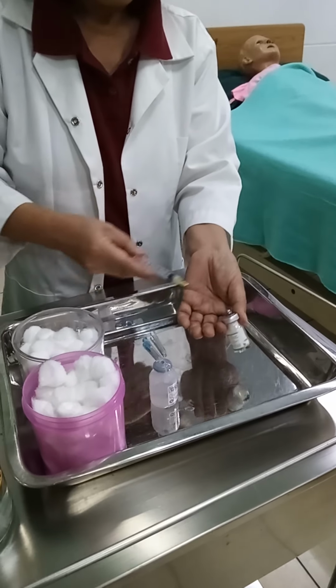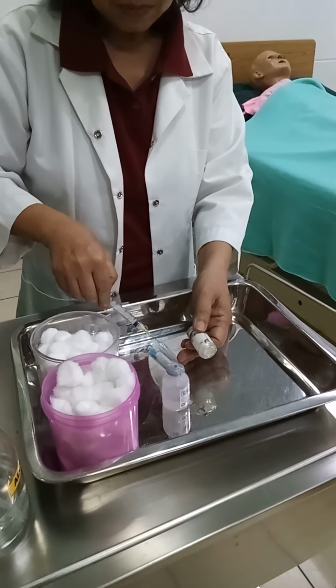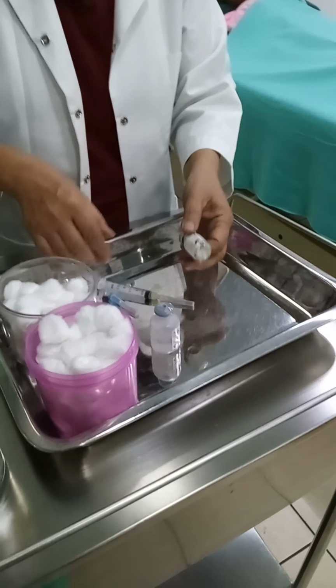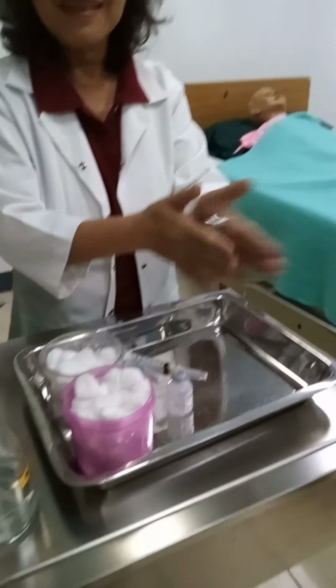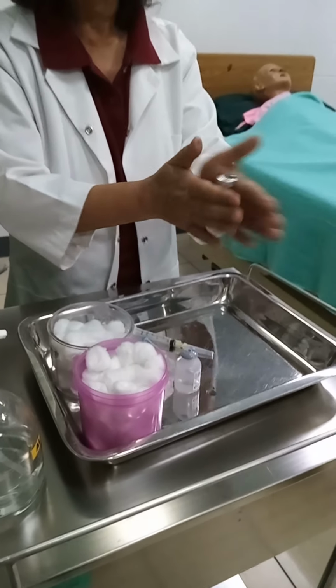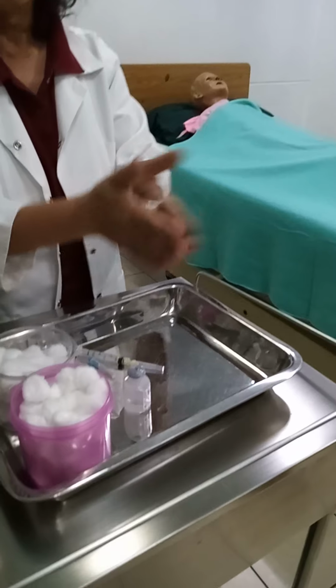Inject air into the vial, holding onto the plunger firmly. Mix the medication thoroughly. Roll in palms. Do not shake.